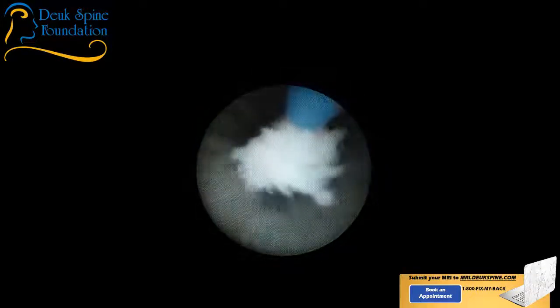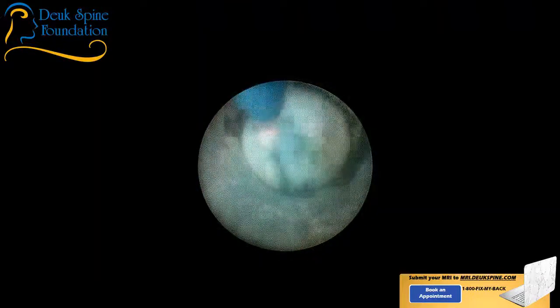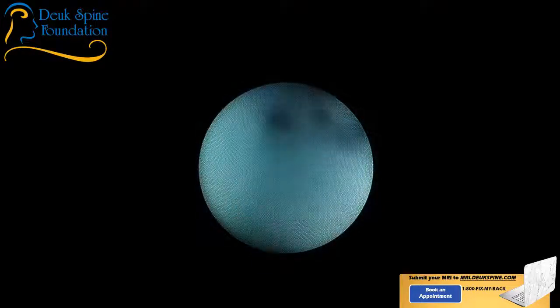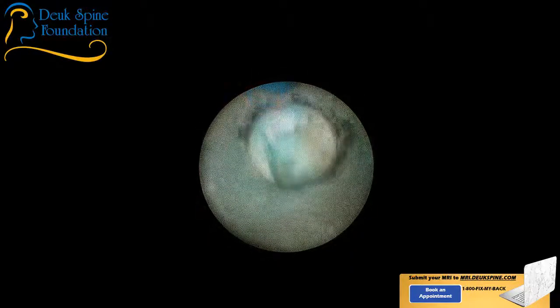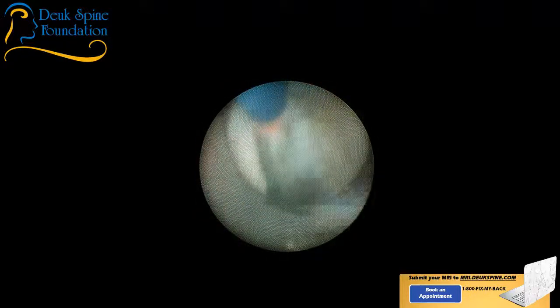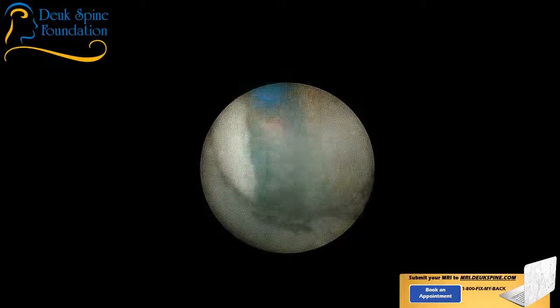So, to me, this herniation doesn't look that old. I don't know when her injury was, but this looks like a more recent herniation. It's not as scarred in. There's another piece. See, normally, for those of you that watch this, you see these chunks are scarred down really good. And I got to work on them for a long time with the laser to get them released. But her fragments are coming out nicely. Oh, look at that. Beautiful.